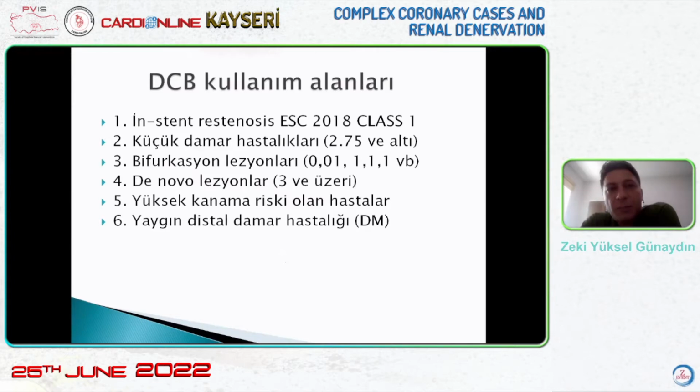And a drug-coated balloon is indicated for certain in-stent stenosis or tiny vessel diseases or bifurcation lesions. And these are already written in the guidelines.